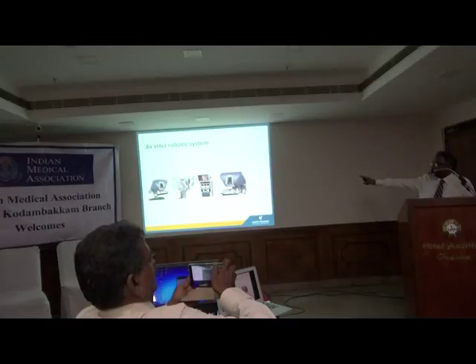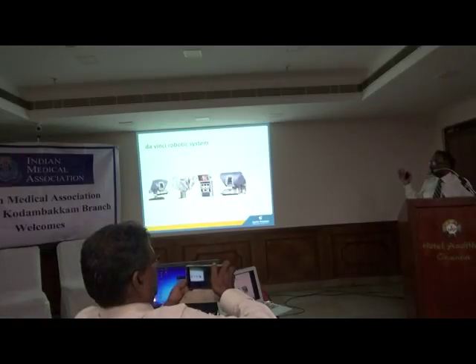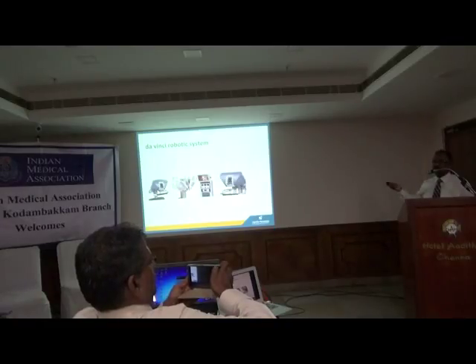The second one is the patient cart where the robotic arms are. So you can see the numbers are 1, 2, 3. The first two we can change the arm. We can have three arms basically. The camera is number one, and the other two we can use for holding and retraction. Apart from that, we can have an extra number of ports with an assistant to help you. And then the vision cart, which is at the center, is where the assistant sees the vision and helps you in the case.